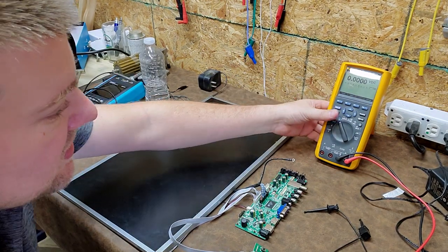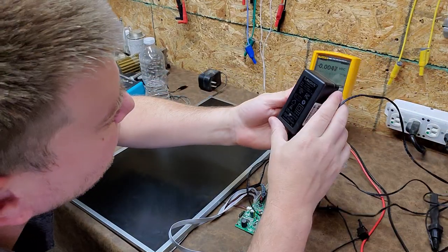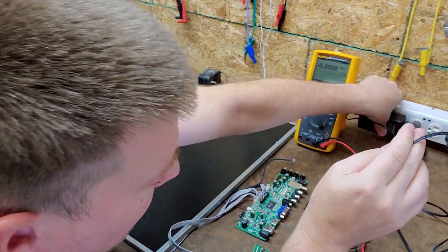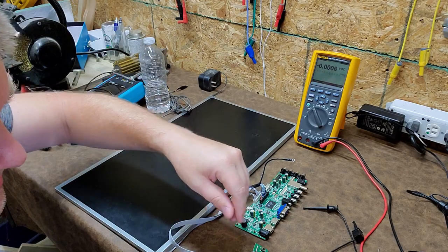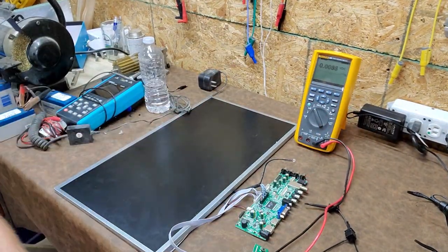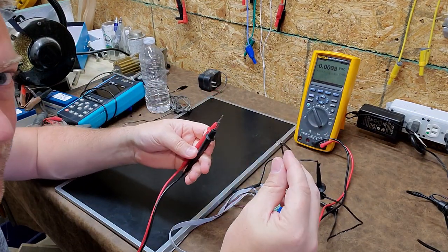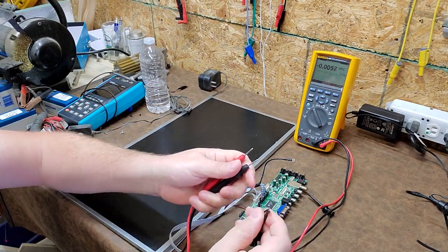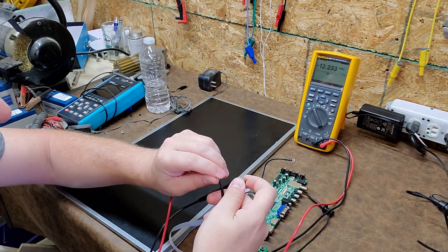So one of the first things I do is I get a 12 volt power supply, and this one is 3.5 amps. So this one should be plenty enough power. I do have some garbage power supplies floating around because you never know when you can use them for testing and stuff like this. 3.5 amps is plenty. So one of the first things I do is check the polarity of the DC power supply, just to make sure that not only do I have voltage, but that I've got it in the correct polarity.